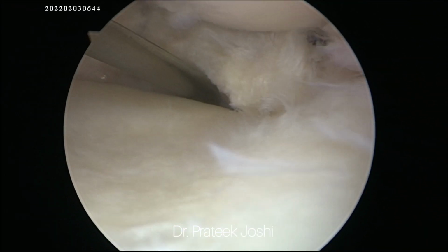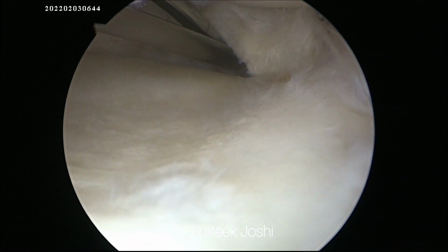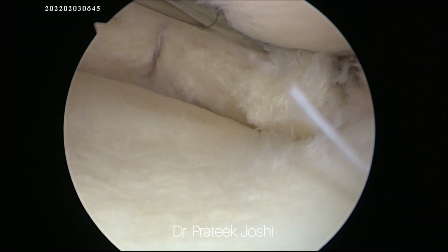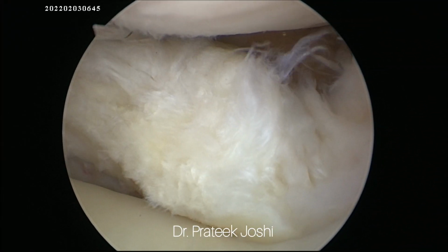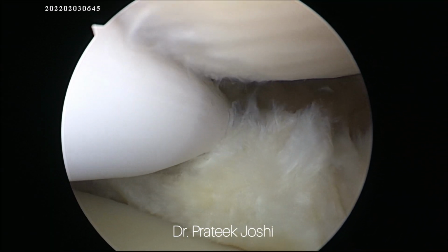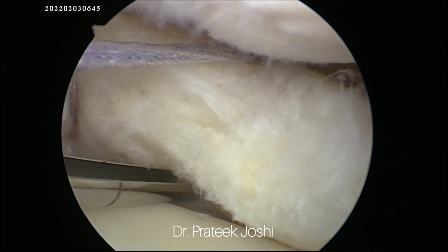Now I'm going to change the portal, I am now viewing from the anterolateral portal. I have introduced my all inside device from the anteromedial portal, and now I'm going to introduce again the device superior to the meniscus. As you can see, my assistant is giving a valgus stress, and all this procedure is being done after we have done MCL pie crusting.